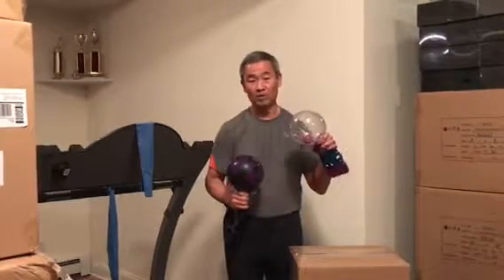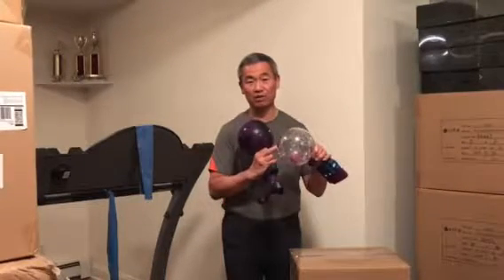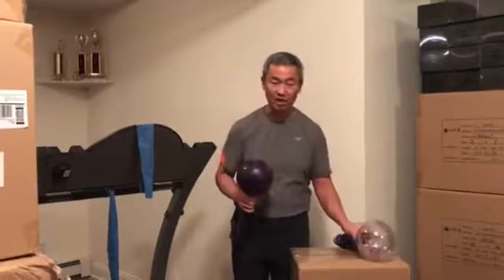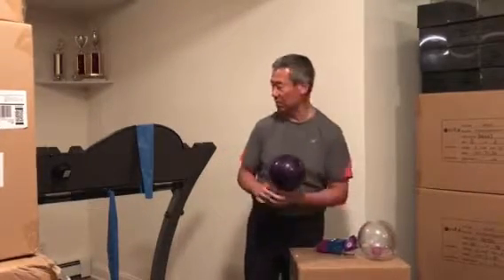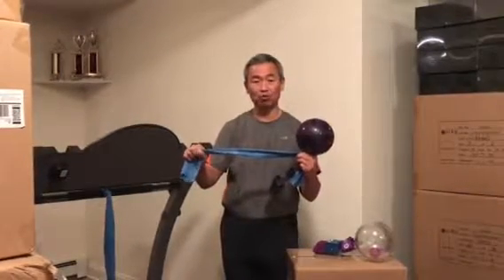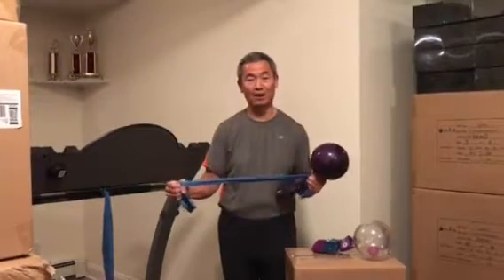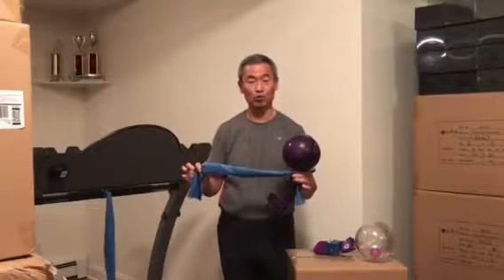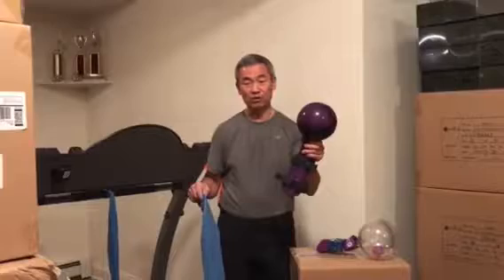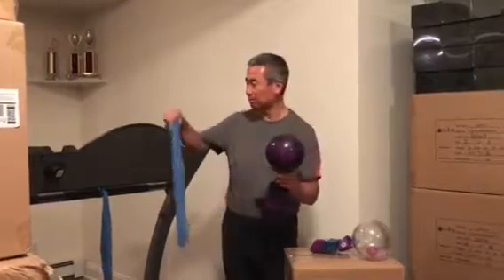The ball weighs 200 grams. The size of the sphere is 15 centimeters in diameter. The equivalent workout is to the middle of the range Thera-Band, whether green colored or blue colored, the stress is approximately the same. So for your research subjects, they should be using the ShoulderSphere 7-ounce compared to the Thera-Band.